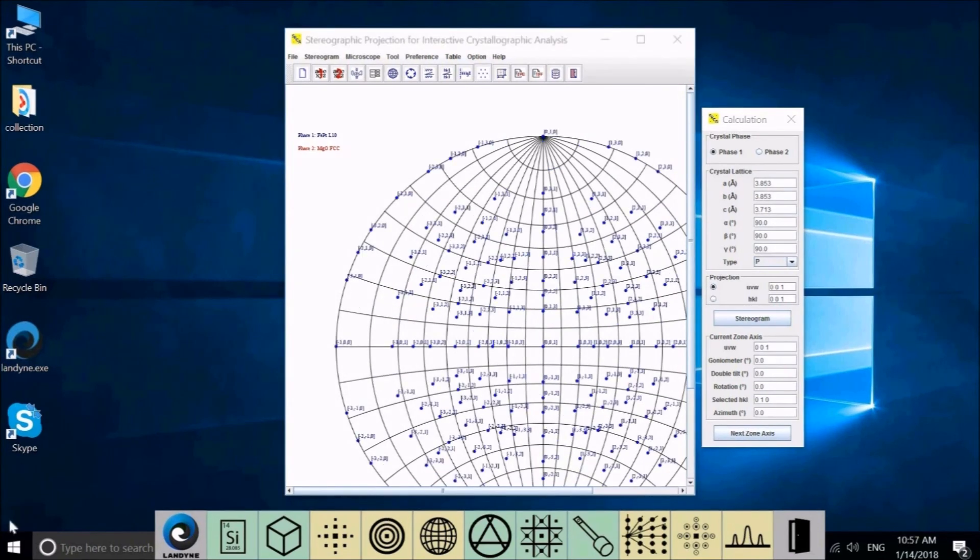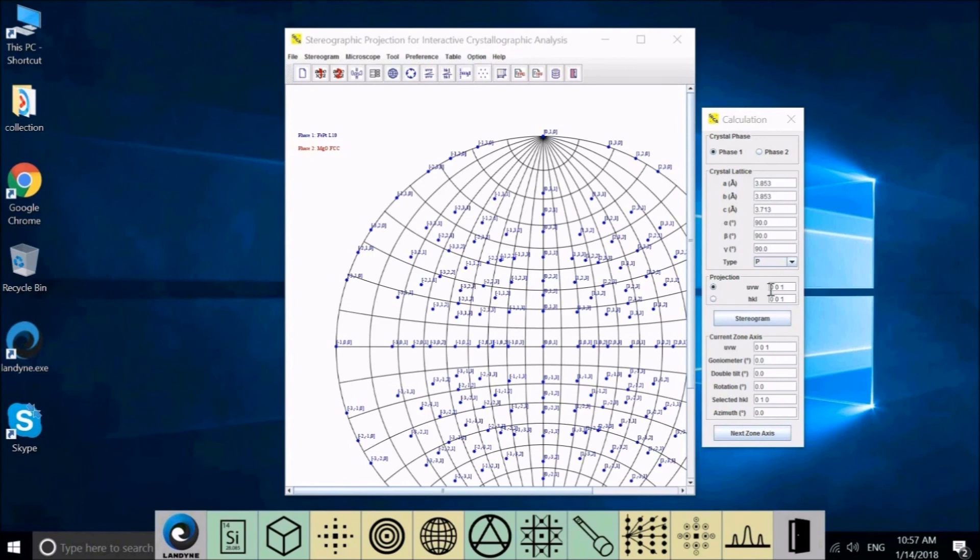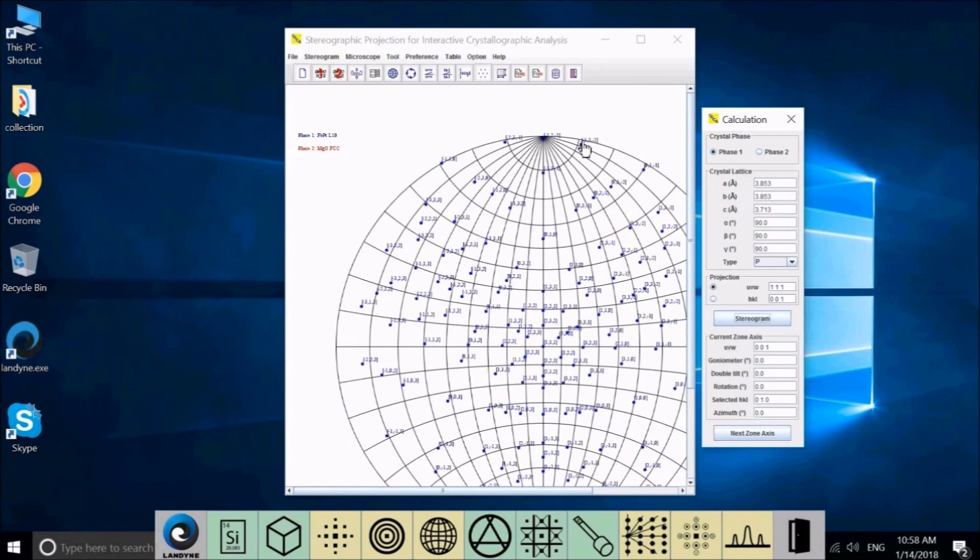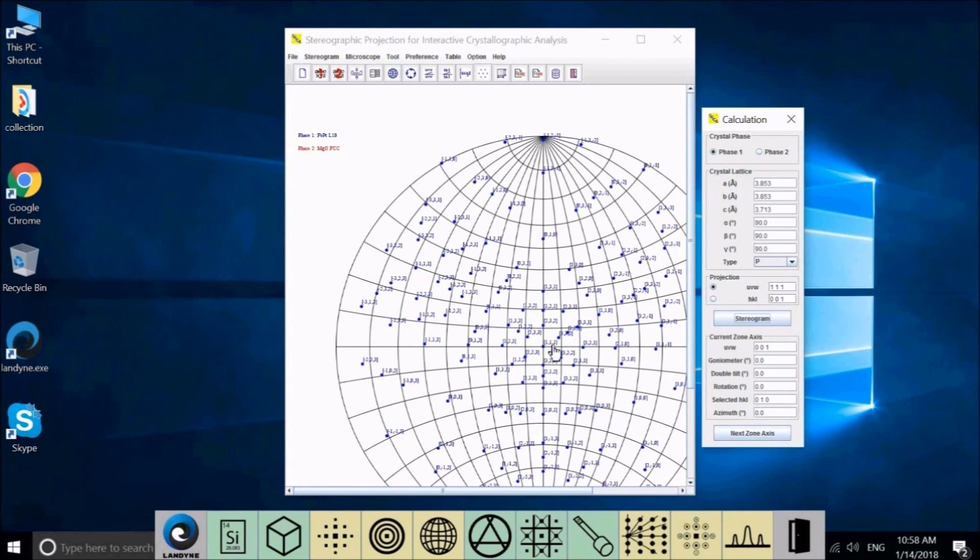Now let's test some variations. We created the first phase. This UVW here is 0, 0, 1. And now we can change it to 1, 1, 1. And redo the stereogram. We'll see the whole pattern change. And the central point now is 1, 1, 1. The relation is the same because it's the same stereoframe, but the view direction has changed.